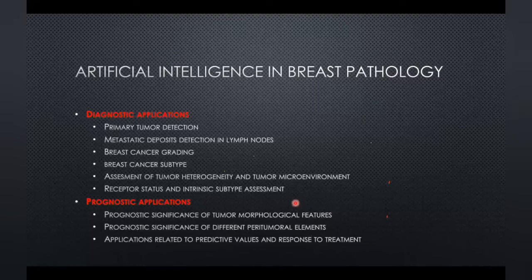So artificial intelligence is being widely used in breast pathology. This is the biggest field in which artificial intelligence is being used now. It has its own diagnostic applications, and it has its own prognostic applications. Now in diagnostic applications, mind you, all these things which I am telling you here are algorithms already made for this, and people are using them in day-to-day reporting nowadays.